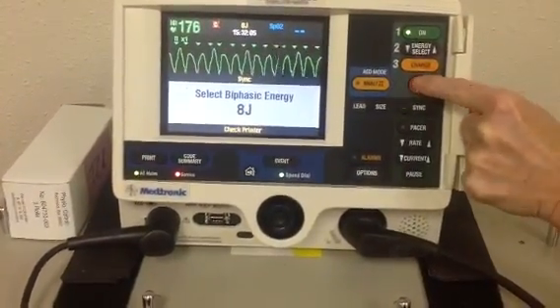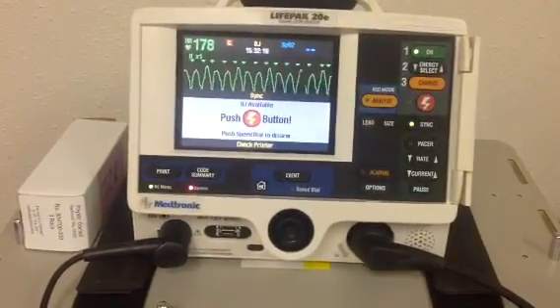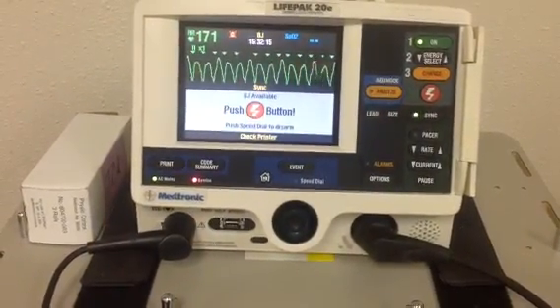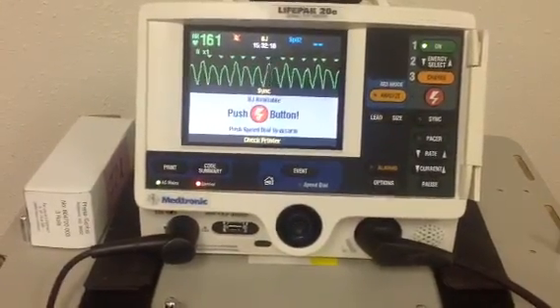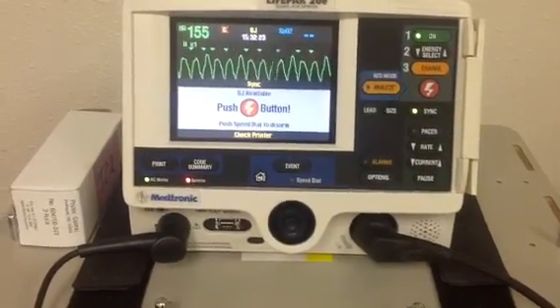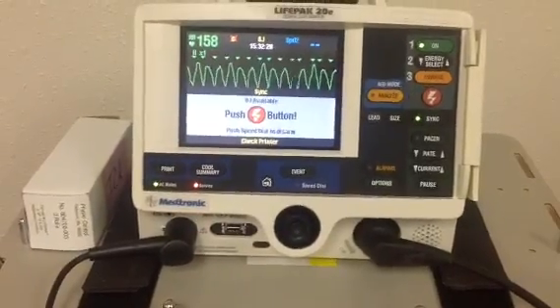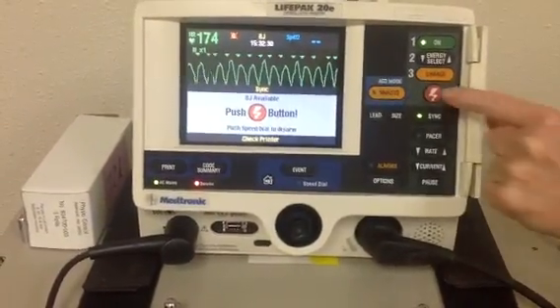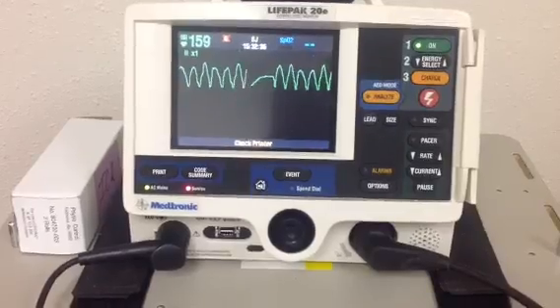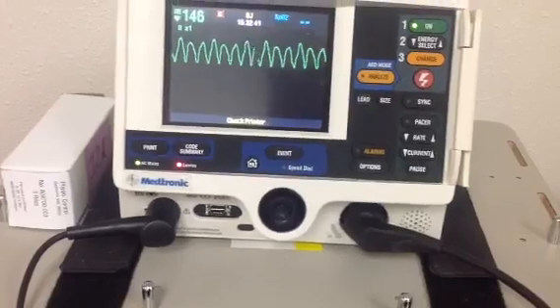Now we need to charge. For the person that's running the defibrillator, it's your job to make sure that the scene is safe. So you need to clearly announce: one, I'm clear; two, you're clear; three, everybody clear. Check to make sure that the bed is clear and no one's touching it. Once you've assured that, go ahead and hit the red button to release the energy. It tells you the energy is delivered. We would hope that would convert our patient back to normal sinus rhythm, but in this case it didn't.